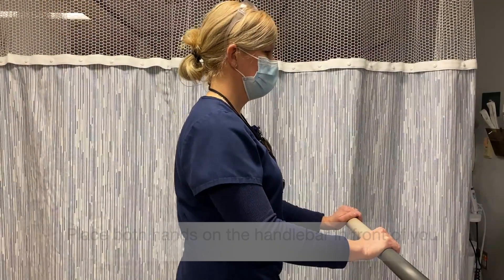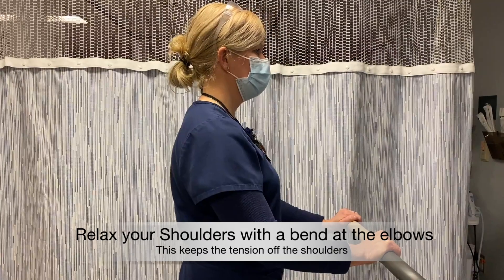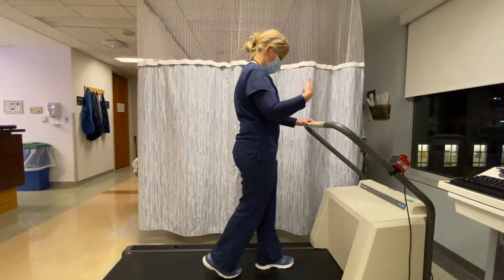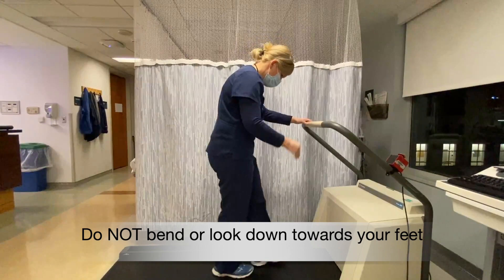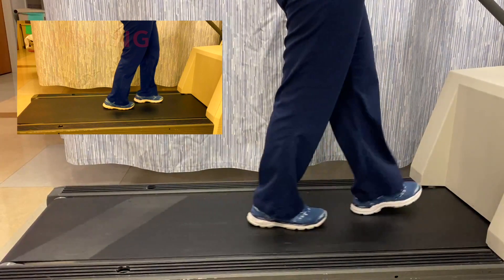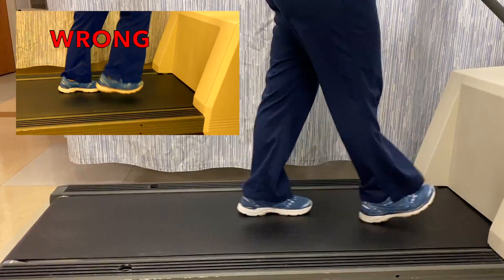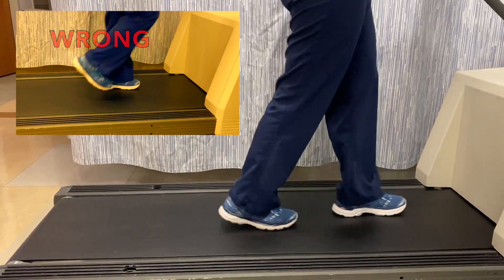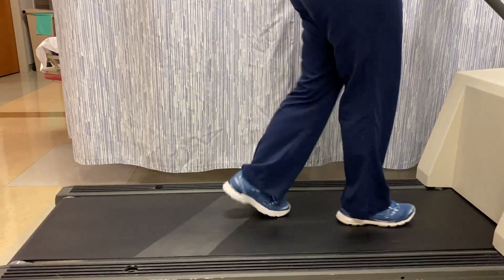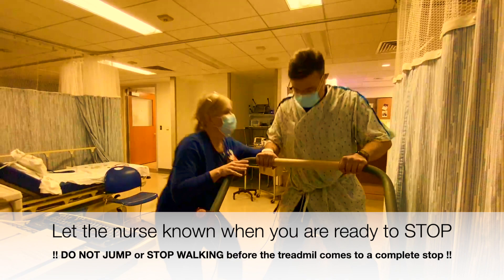Place both hands on the handle bar. Relax your shoulders with a bend at the elbow to keep tension out of the shoulders. Look straight ahead and not down when walking. Walk in a heel-toe approach. Stay in the middle of the treadmill and closer to the front of the machine. If you need to stop, please let the nurse know. Do not jump off the treadmill.